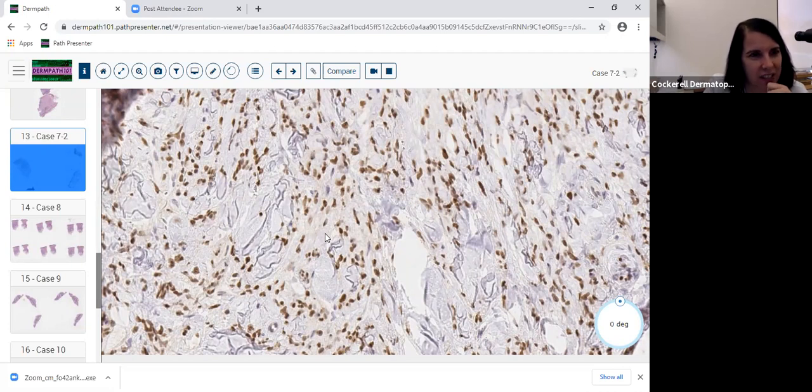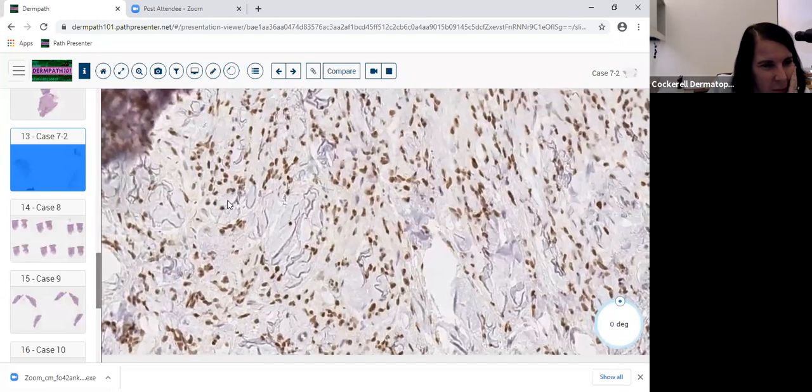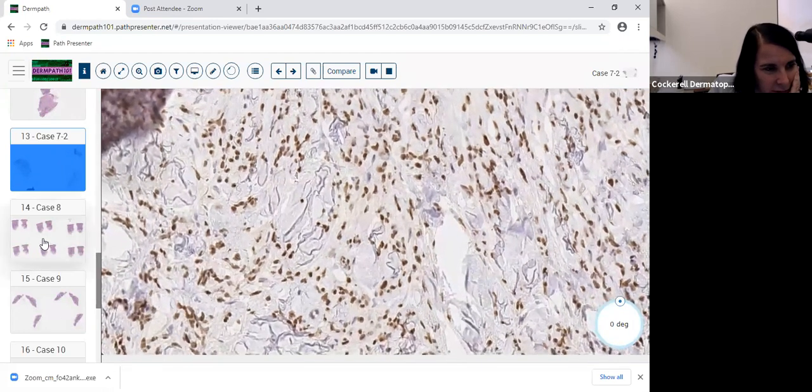But in the case where you see those dendritic processes and you see those spindled cells, you would definitely think about blue before you would think about that. With a DFSP of Bednar, you're going to see the melanin more in the macrophages, and sometimes they'll pick up in some of the tumor cells, but you won't see those dendritic processes in a Bednar. All right, here we go on to the next case.